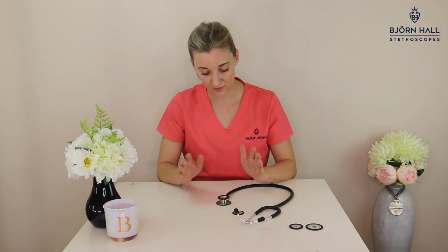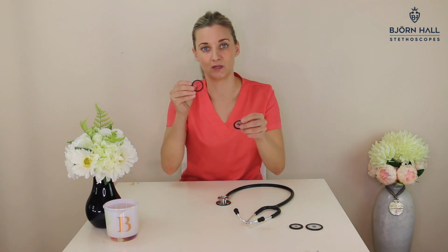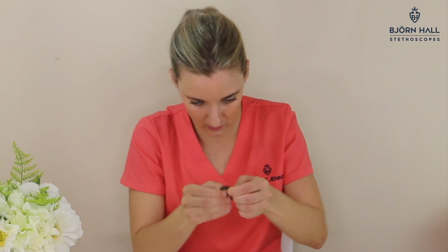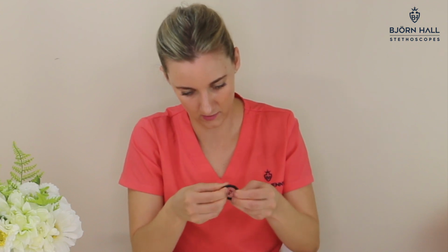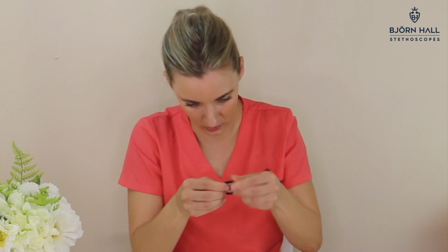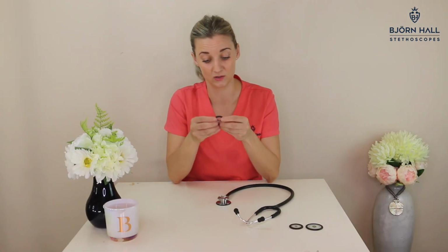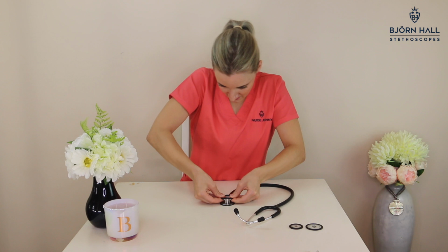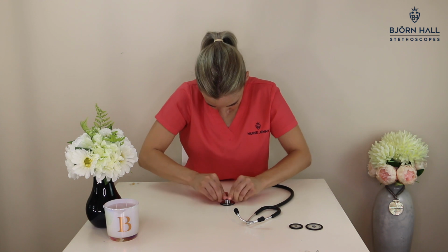Like so. And then when you've left it on for a while, take it off. Put the diaphragm back into the outer rim, and you do so by getting it into the groove and working it all the way around. And then make sure they're in the groove properly. Alright, once you know you've got them in the groove, you put it on like you would before, and you're going to find that it is easier to get it on. So you get it on one side, push down on the other, work it all the way up, work it all the way down, push it in, and there it is. It's easier to get it on.